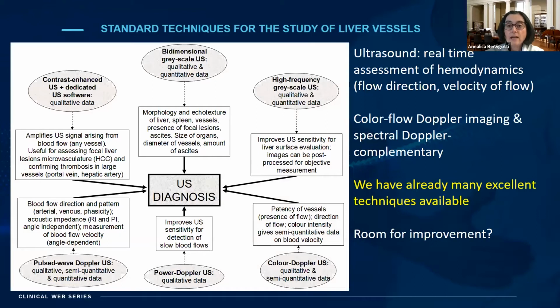And as experienced physicians in ultrasound, I think you are all familiar with the standard techniques that we use, which go from standard bidimensional grayscale ultrasound to the Doppler-based techniques, which can be color Doppler, spectral Doppler, or power Doppler, and to the last important development, initially, at least as Professor Piscaglia underlined, a Doppler-based one: contrast-enhanced ultrasound, which can improve Doppler techniques much, but then evolved into something different and an important standalone technique.